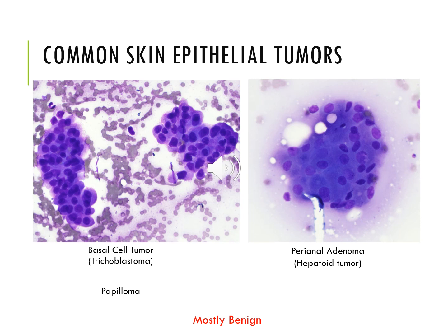And then we have these smaller cells kind of scattered along the edge here, and those are called basal reserve cells. But it's very uniform. You have the big hepatoid cells, which look very similar throughout, and then you have these small basal cells along the edge, and that's very characteristic of a perianal adenoma, and these occur very frequently. We see them almost weekly here on cytology.